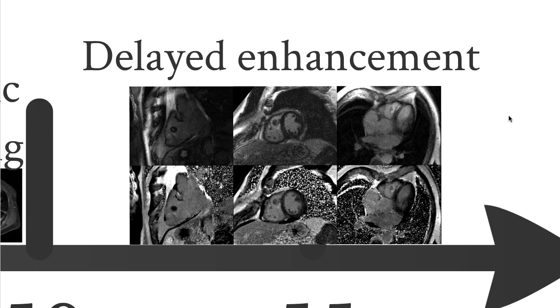Delayed enhancement, so we want to see, is there contrast being retained in the mass? Similar to the way we look for contrast being retained in scar or fibrosis, for example, in patients post-MI. So here's an example of that. We'll see a little bit of enhancement in this mass late.